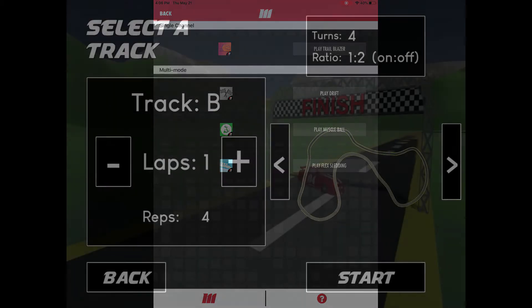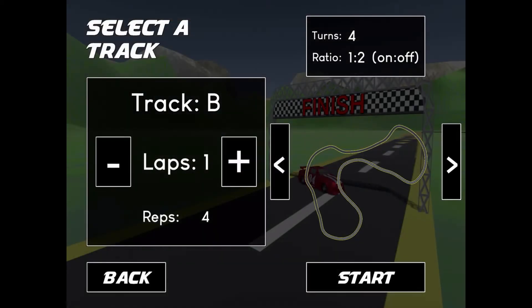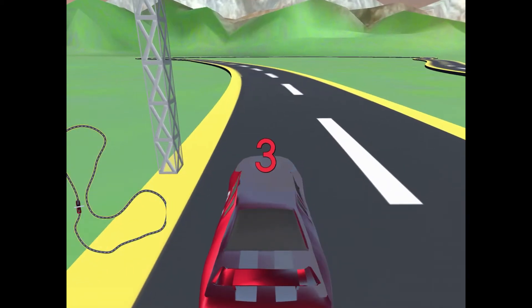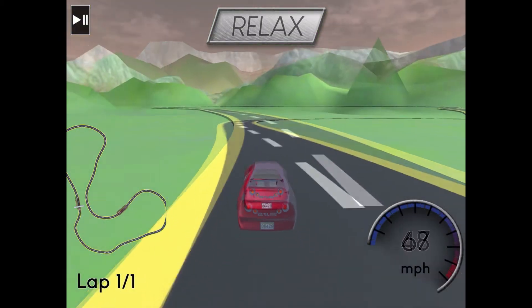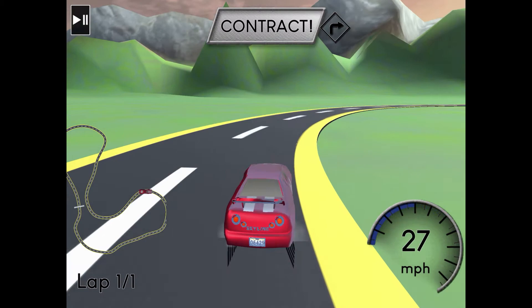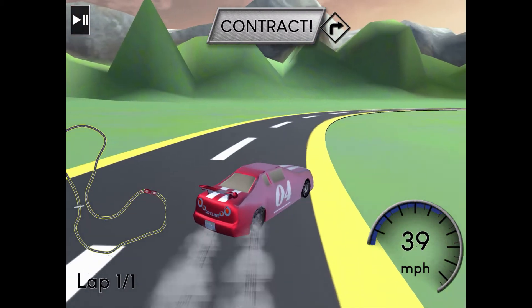In Drift, choose your cup and track, set your number of laps, and you're off to the races. Use contraction and relaxation to steer your car around curves and make it to the finish line.